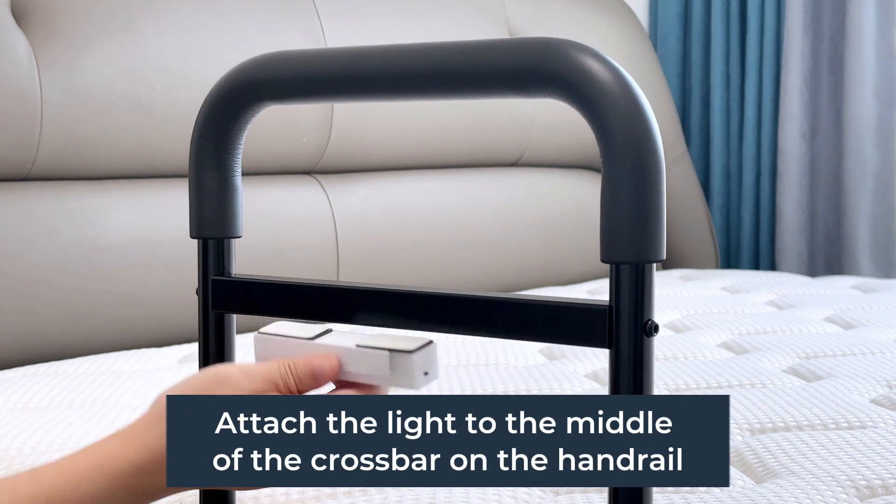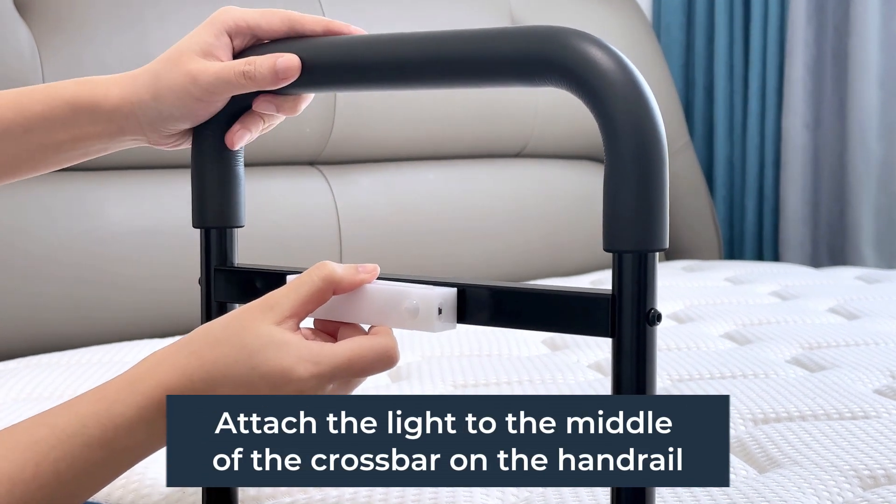Step 5: attach the light to the middle of the crossbar on the handrail.